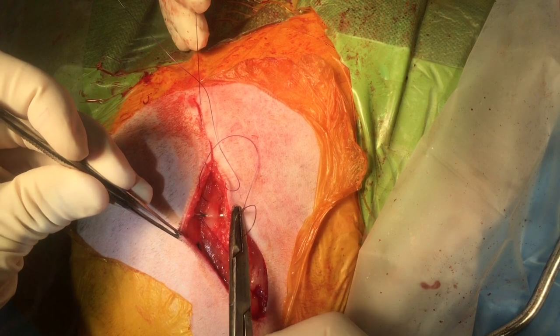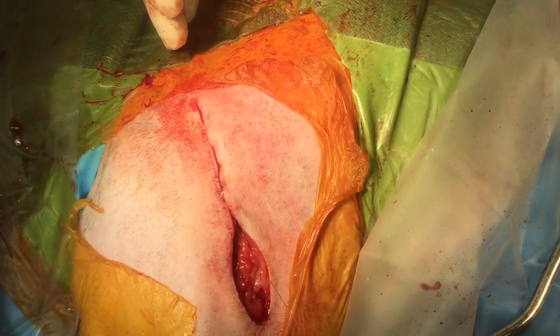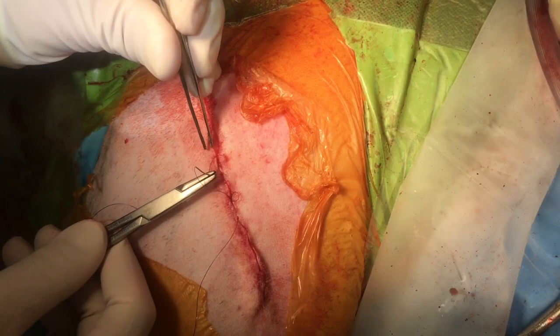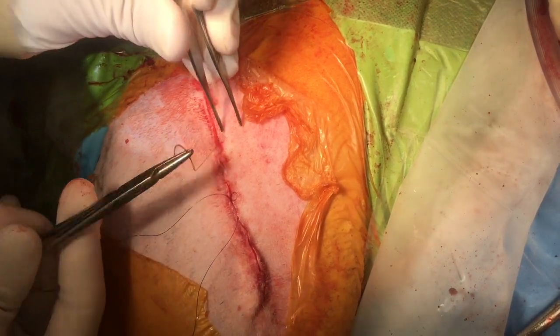The subcutaneous layer is opposed, and an intradermal pattern is used as the final closure layer.